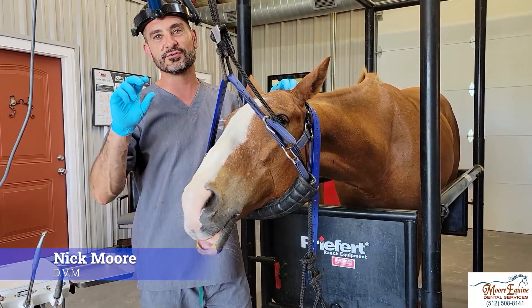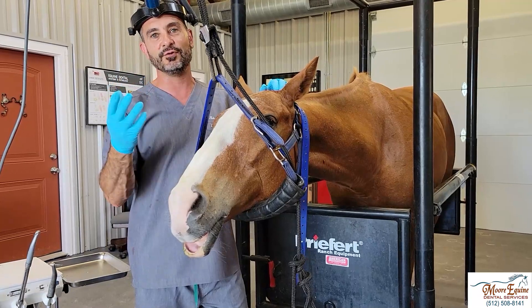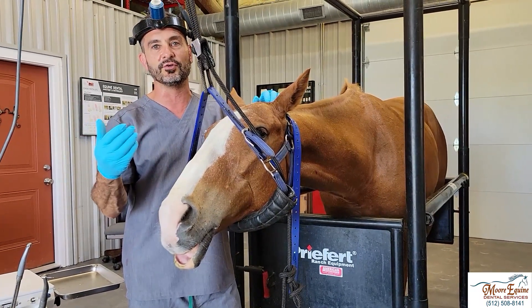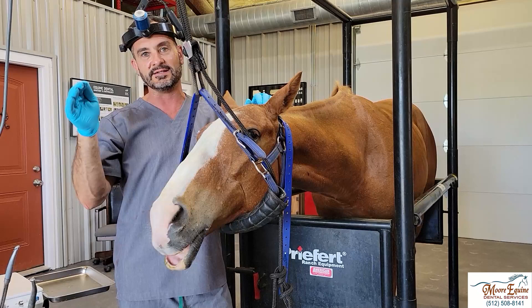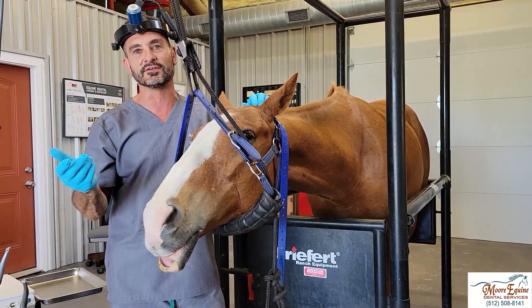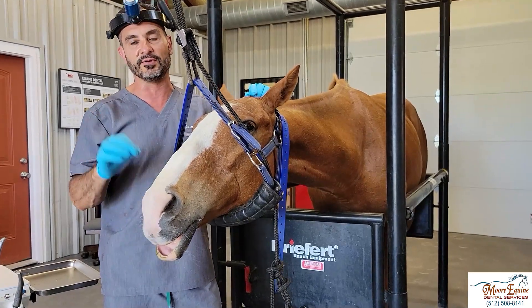Sometimes horses will injure their teeth, especially the incisors and canines, and if you catch it soon enough you can often save them. We can do either a root canal procedure or a pulp capping, where we remove part of the pulp and seal the tooth off so the tooth can be saved without an extraction. Here we've got a case where we're going to show you how that's done on a canine.